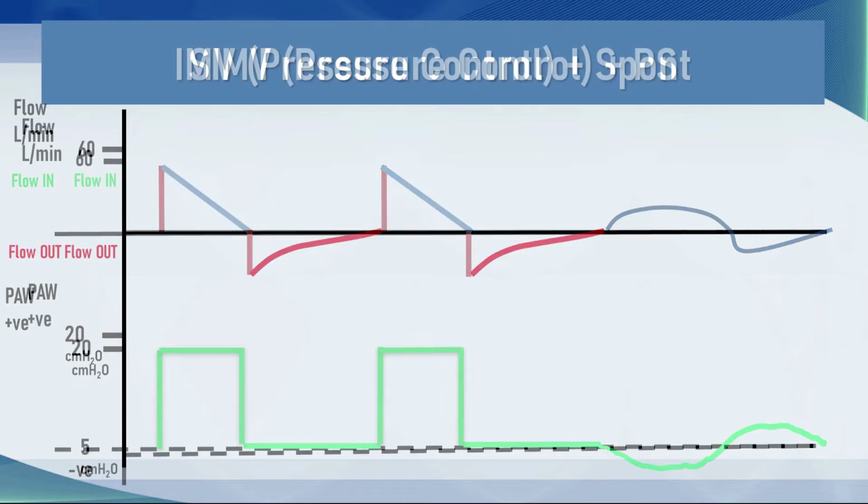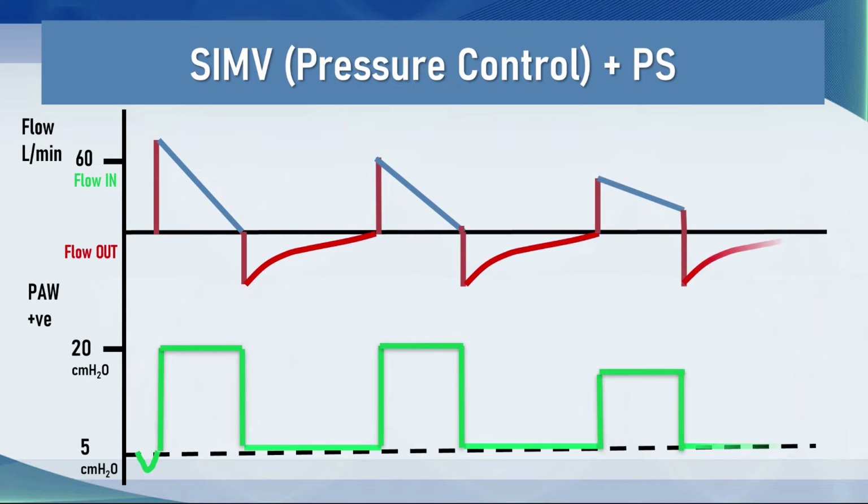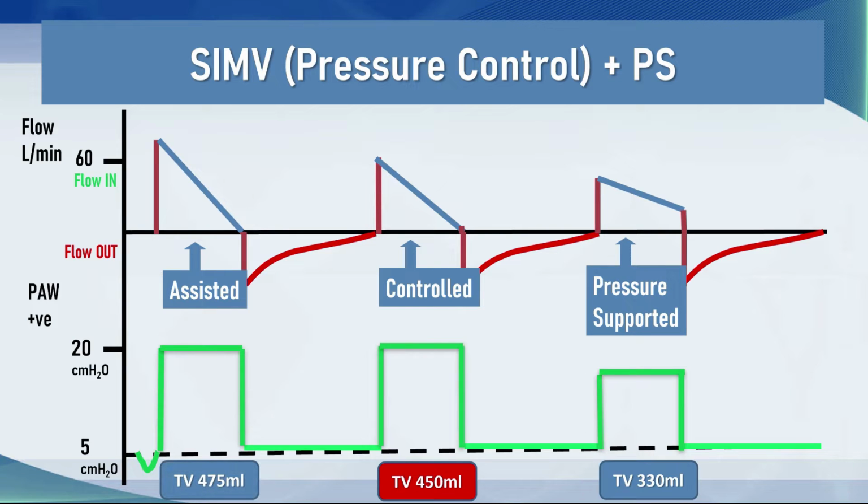They'll become dyssynchronous. Of course, the natural evolution of this was the SIMV version that I mentioned in a previous tutorial. And this is an interesting mode of ventilation. Again, it has controlled breaths, assisted breaths, and pressure-supported breaths.